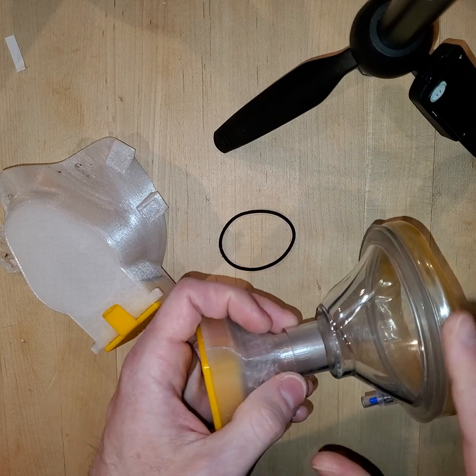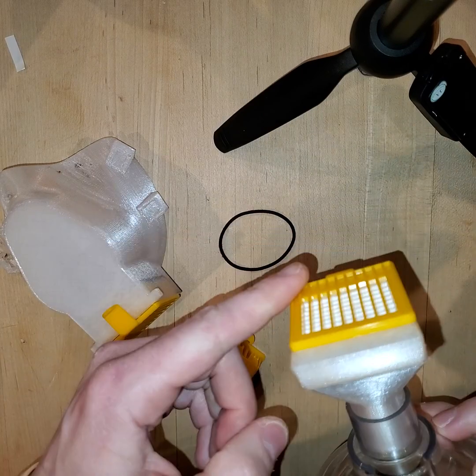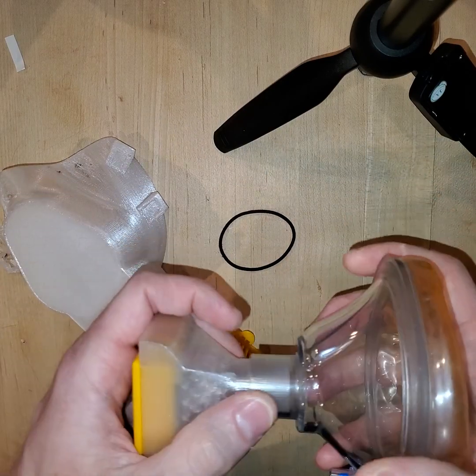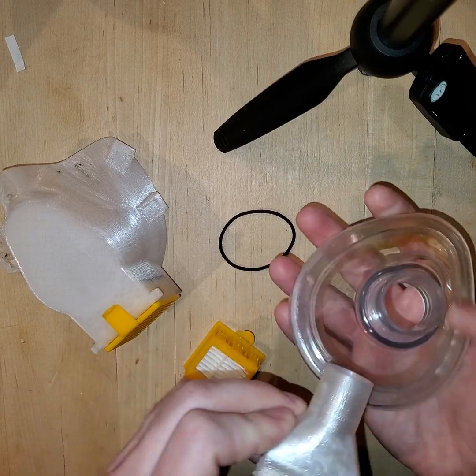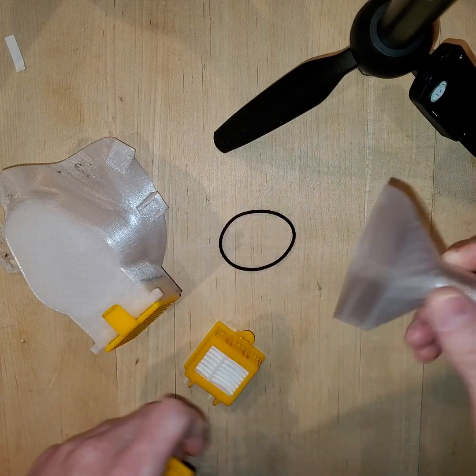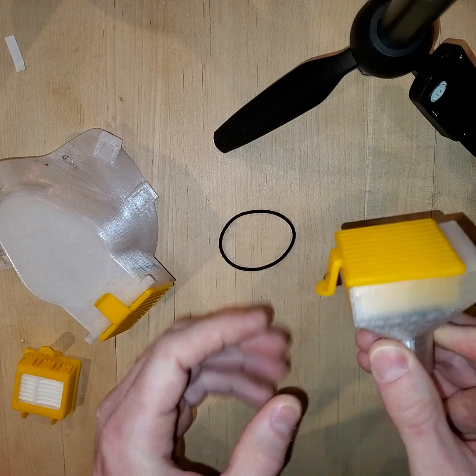Now let me explain. I'm not recommending using a mask like this. This is not what I would use. It's pointing straight out at the patient. I don't like the idea of someone coughing right at my filter. It's just rapid contamination. But a lot of masks have a port down here at the bottom, off to the side. The idea is this can be used with any of them. And what's nice is you pop it out, you toss the filter, grab another one, pop it in, and you're good to go.